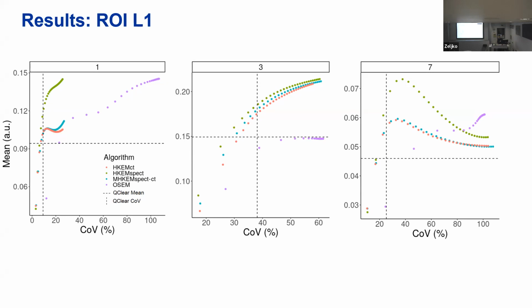So the beta factor parameter was optimized by the group in Oxford in terms of image quality. So we use that one as comparison. So we can see that the green plot is always providing, now I'm not showing all the 10 plots, but they are quite consistent. So the green one is always providing higher uptake, which is the one using PET-SPECT information.